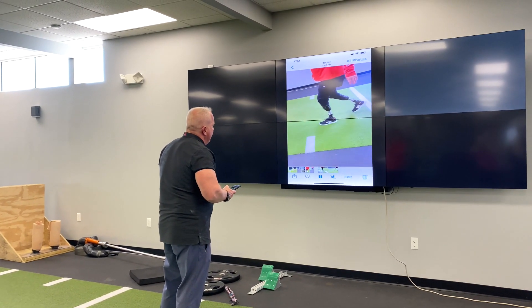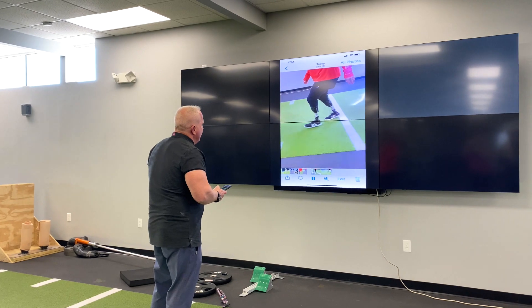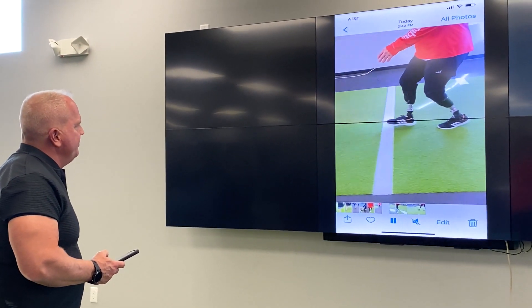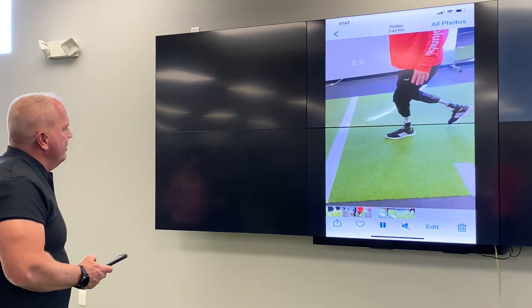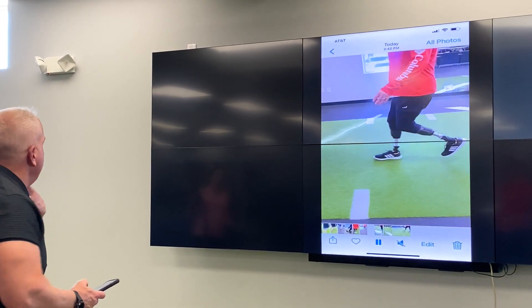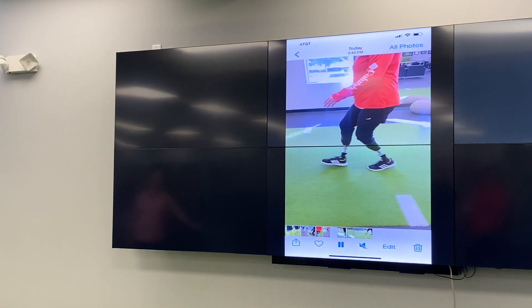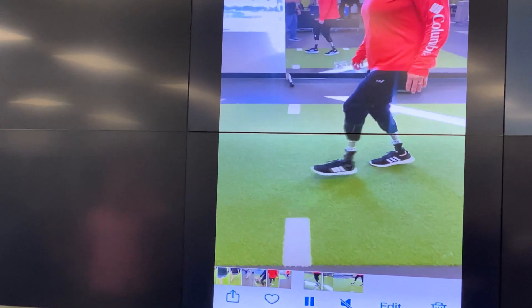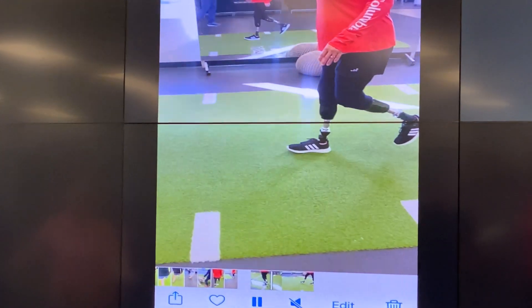See how you're able to get flat there and just almost like a defensive back backpedal. Now watch what happens when you stop and then you have that ground stability — that whole thing will sink down, just like a DB going down.